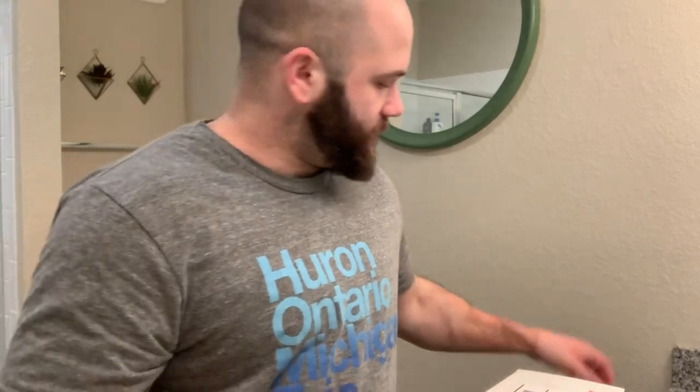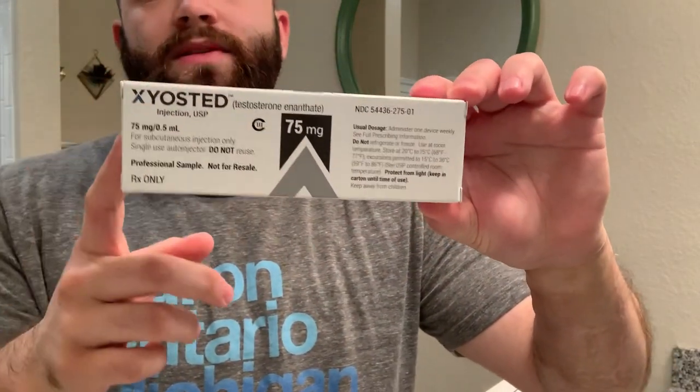Hey guys, I just wanted to make a video because I know I had spoken about the testosterone that comes in the EpiPen style. I didn't know that I wanted to last time make a video of myself injecting it. I thought I was recording the video but I wasn't, so I'm gonna go ahead and do that this week.